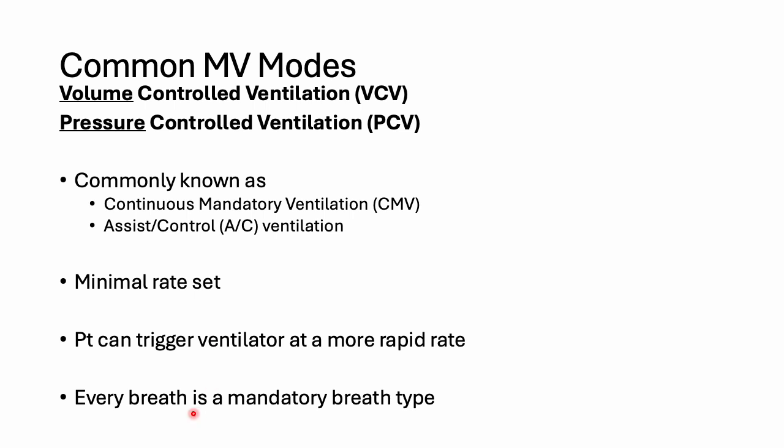But each breath, whether it is purely machine delivered or triggered by the patient, is a mandatory breath type. This is a concept that you need to understand. When it's VCV or PCV, all breaths, whether they are triggered by the patient or not, are machine breath types.